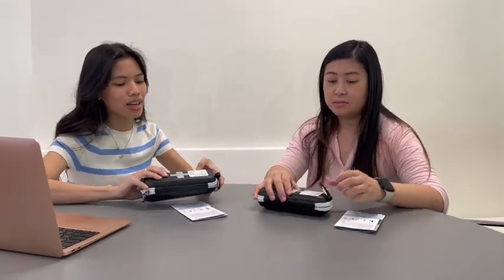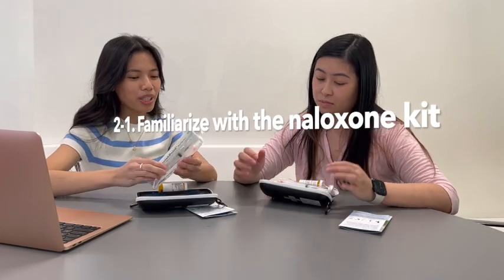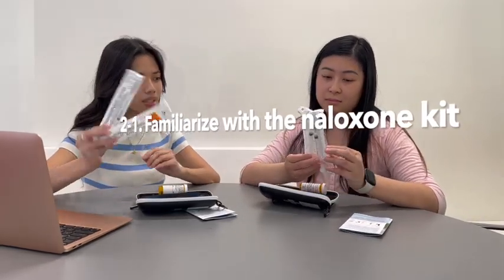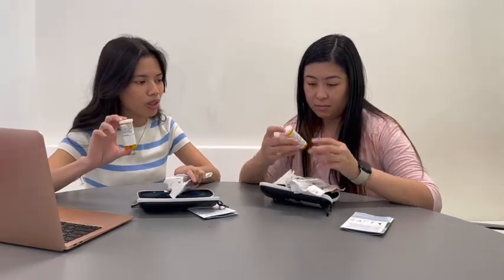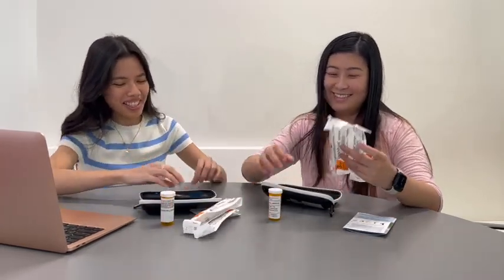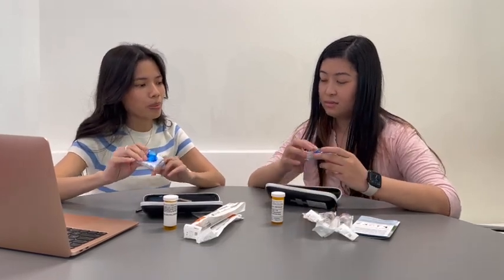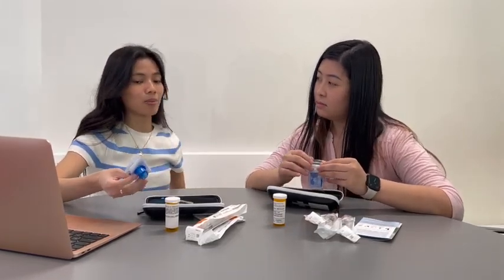So we'll move on to the next part, but before we learn how to properly administer naloxone, we'll go over and familiarize ourselves with what's inside the naloxone kit. You can open it with me. First we have 3 syringes, 3 ml syringes, and then 3 ampules of naloxone inside. And there's also a CPR barrier shield. If we need to give breaths to the patient, then we have to use that.